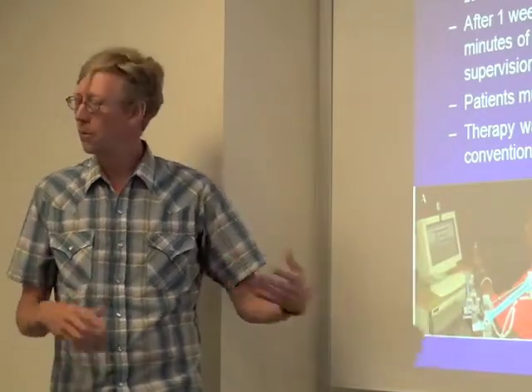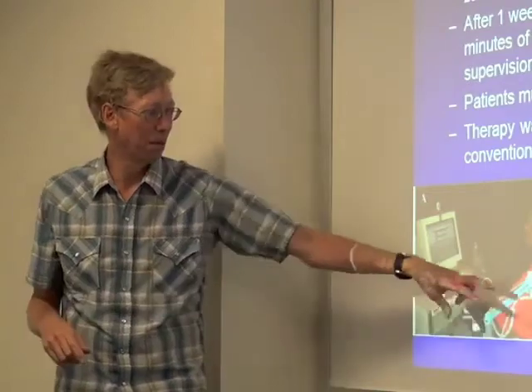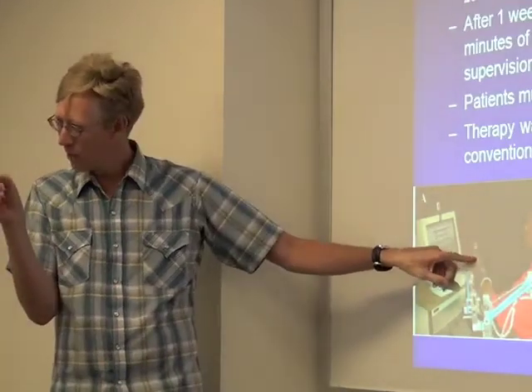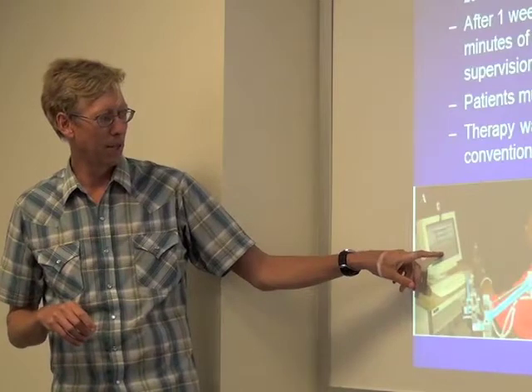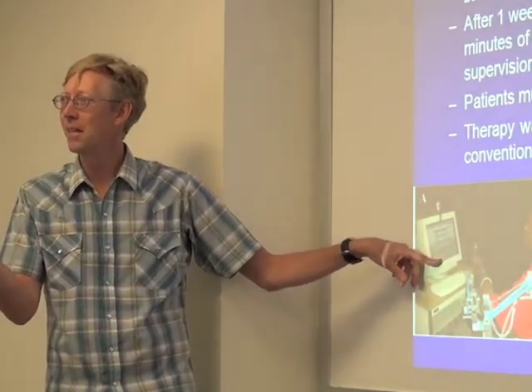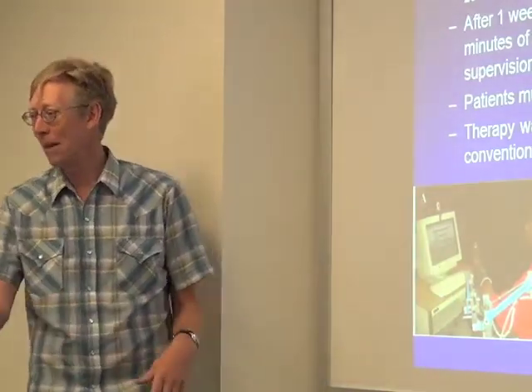So now someone who, like in that video, can barely lift their arm and can't use their hand, all of a sudden, if you put their arm in this, they can move their arm better because it's like it's floating in a pool. And if they can only move their hand a little bit, we detect that, and they can control an avatar representing their hand to pick up and release things. People find this really motivating. Someone who could never pick up this cup can now, in the virtual world, pick up a cup and put it down.